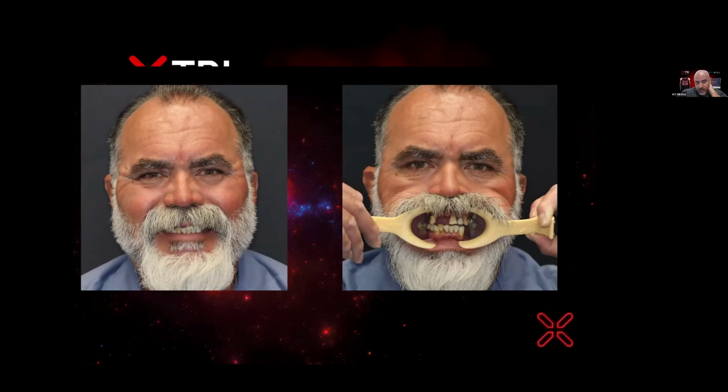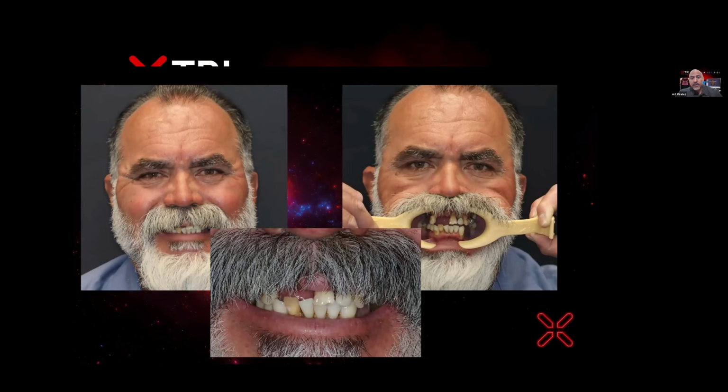This is Alex. Most of our male patients, as you know, have a lot of facial hair, and we all know why they have facial hair, right? Alex was very open and honest. He said, "I have facial hair, doc, because I'm so embarrassed. I'm so ashamed. I don't even like to talk to people. I work in a position where I am forced to talk to people, but I'm just not comfortable." So he grew this long mustache to cover his smile. You can see what it looks like with the retractors there. Here's a close-up of his smile, which we had to force him to show because it wasn't natural.